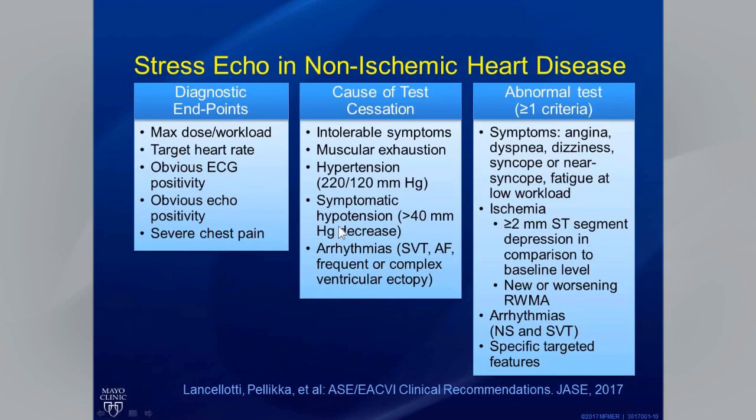Causes of test cessation include intolerable symptoms, exhaustion, hypertension, and a blood pressure of 220 over 120 is suggested, symptomatic hypotension, and a 40 millimeter mercury drop in blood pressure is suggested. Significant arrhythmias would also be a reason to stop the test.